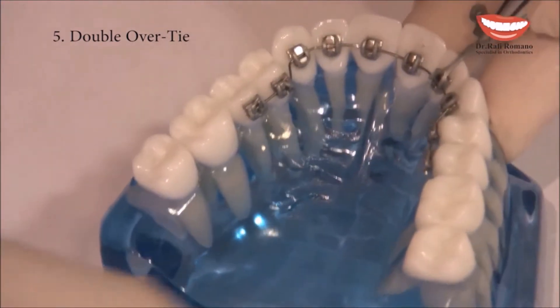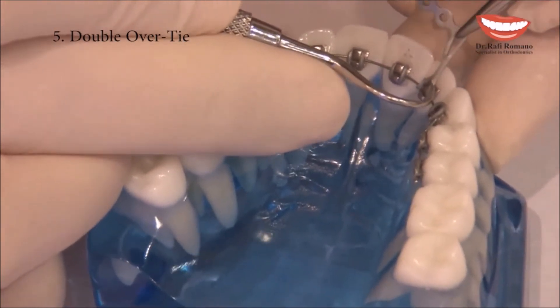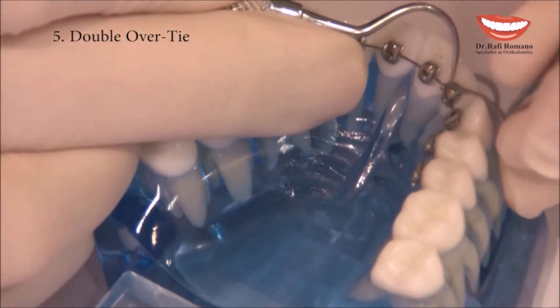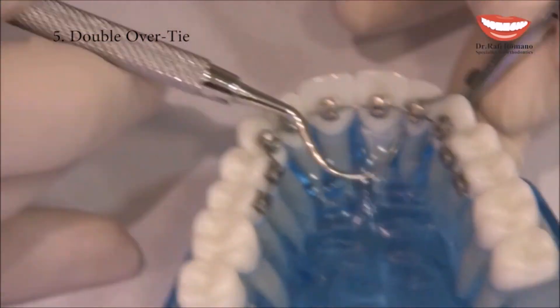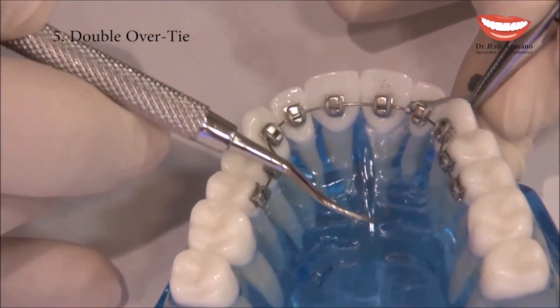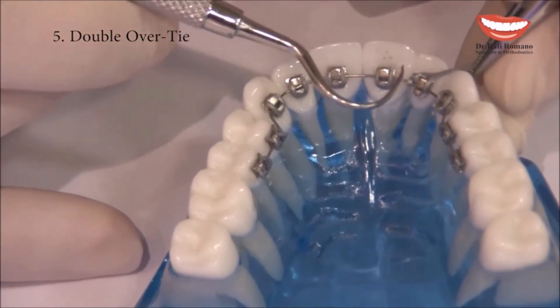What does this Double Overtie do? It not only secures the wire deep in the slot, but also creates an active force on both sides, pushing the wire inside. In this way, we can even do partial ligation.